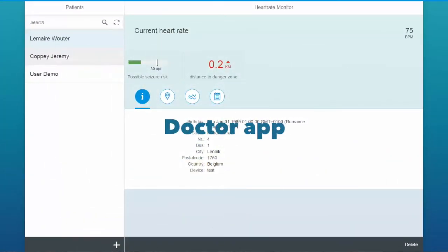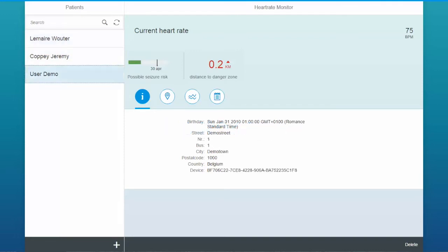Last but not least, we have the doctor application. This is an SAPUI5 application where the doctor has an overview of all his patients. On the first tab we have the general information of a patient.